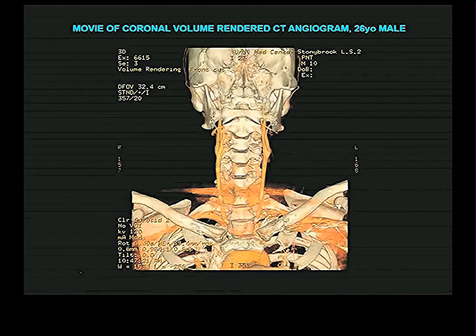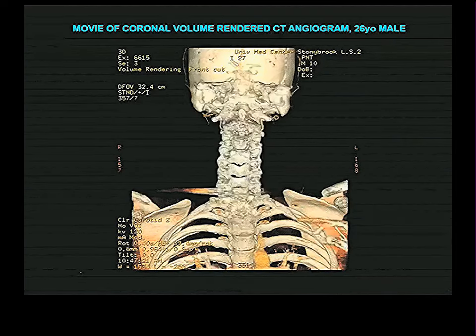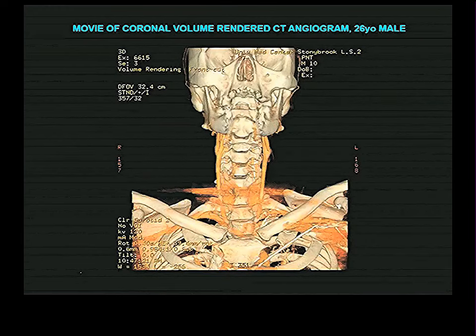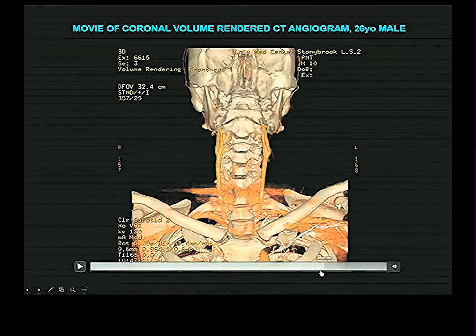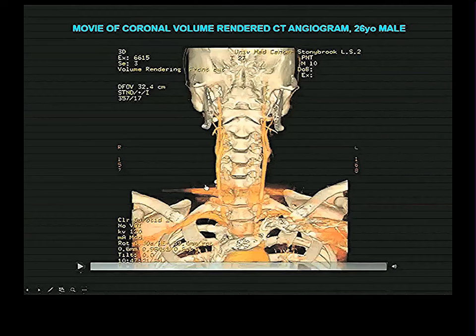And we're going from front to back in sections. We're coming out the back of his skull. And now we're coming forward again. Now, what can you really see in this? All right, we can see here's the common carotid coming up. Here's the superior thyroid coming down on that side, probably superior thyroid here on this side. We'll see it better in lateral view. We see the bifurcation. We know that the anterior one is the external carotid, the posterior one is the internal carotid. Otherwise, we see beautiful vertebrae, gorgeous vertebrae.